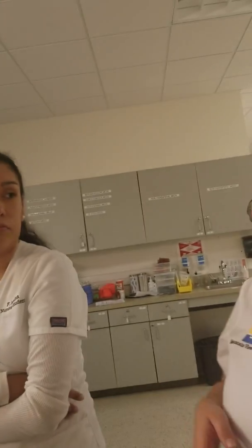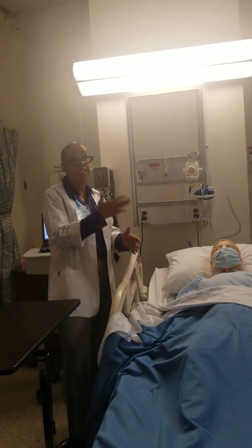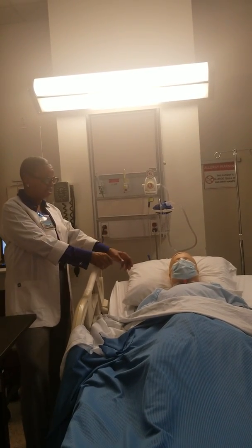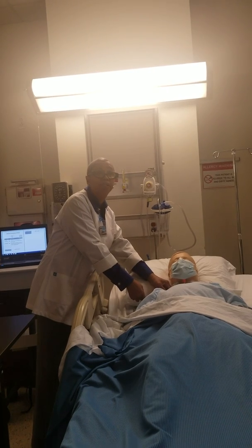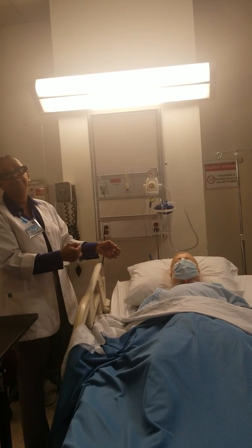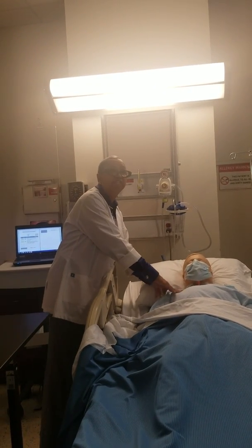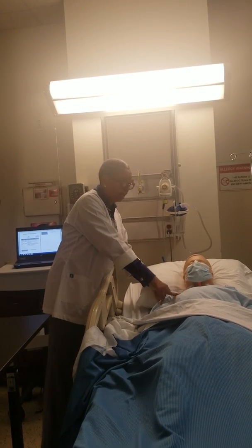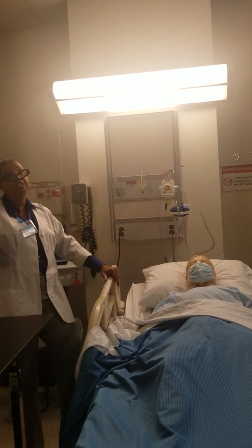So let's just say you started changing and you realize that the line, the lumen, is actually further out than it's supposed to be. At that moment, would you stop and get them to reinsert it, or what would you do? I'm going to finish dressing it, and then note that this is too far. Follow up, get an X-ray or whatever. I'm not going to stop unless I knew before I started messing with it. If I've taken it apart and that's when I realize this thing has come out, maybe from me pulling it, then I have to finish dressing it. I can't leave this unexposed. So I finish dressing it, but I don't push it back in. No, I just make a note that it looks like I moved it. Maybe I need a chest X-ray.